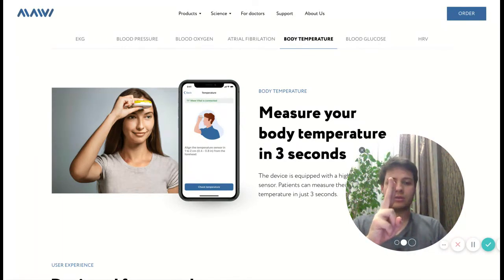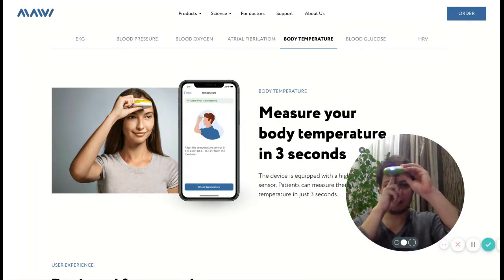Put your fingers on your forehead and place the device so it touches your fingers. In just 2 seconds, my temperature is measured.